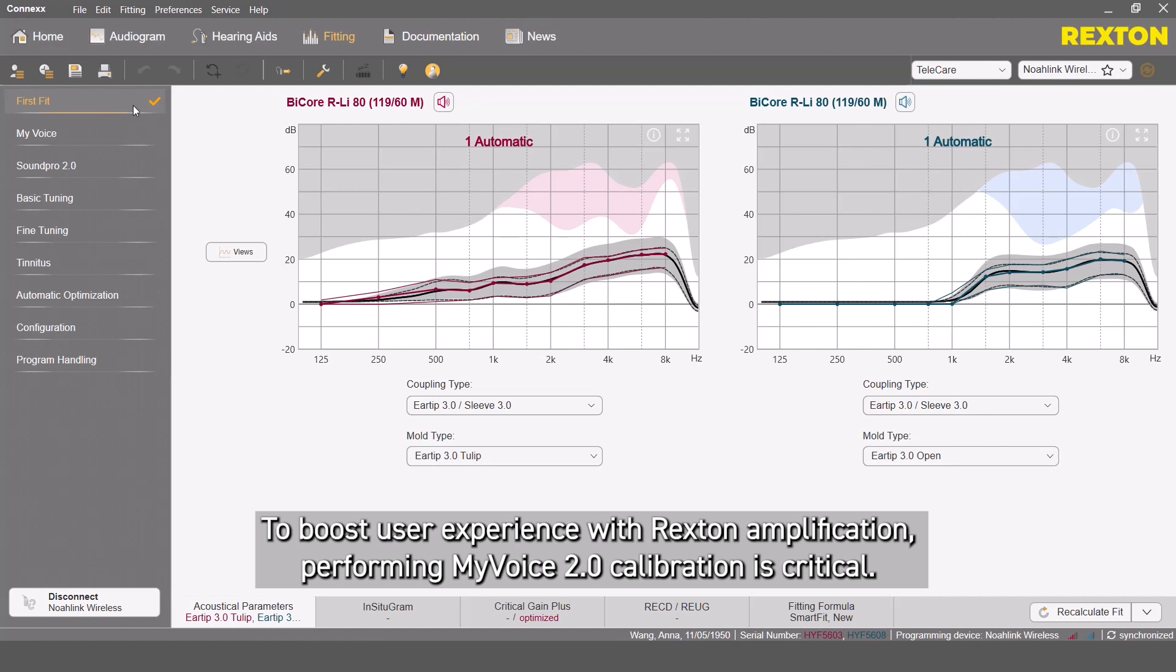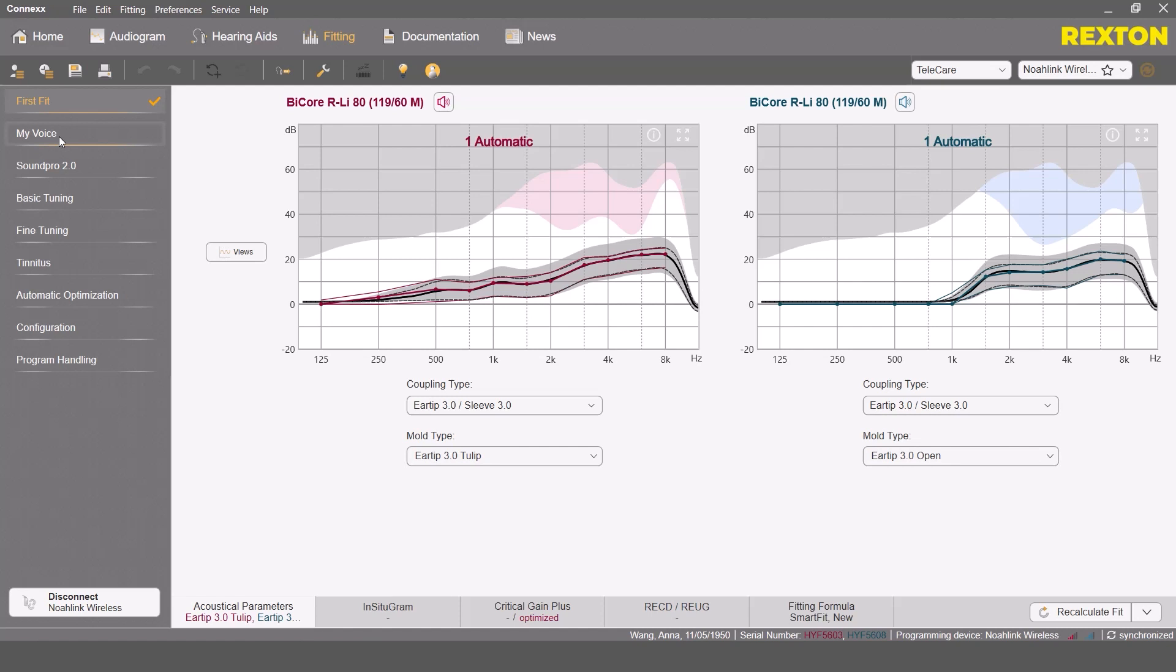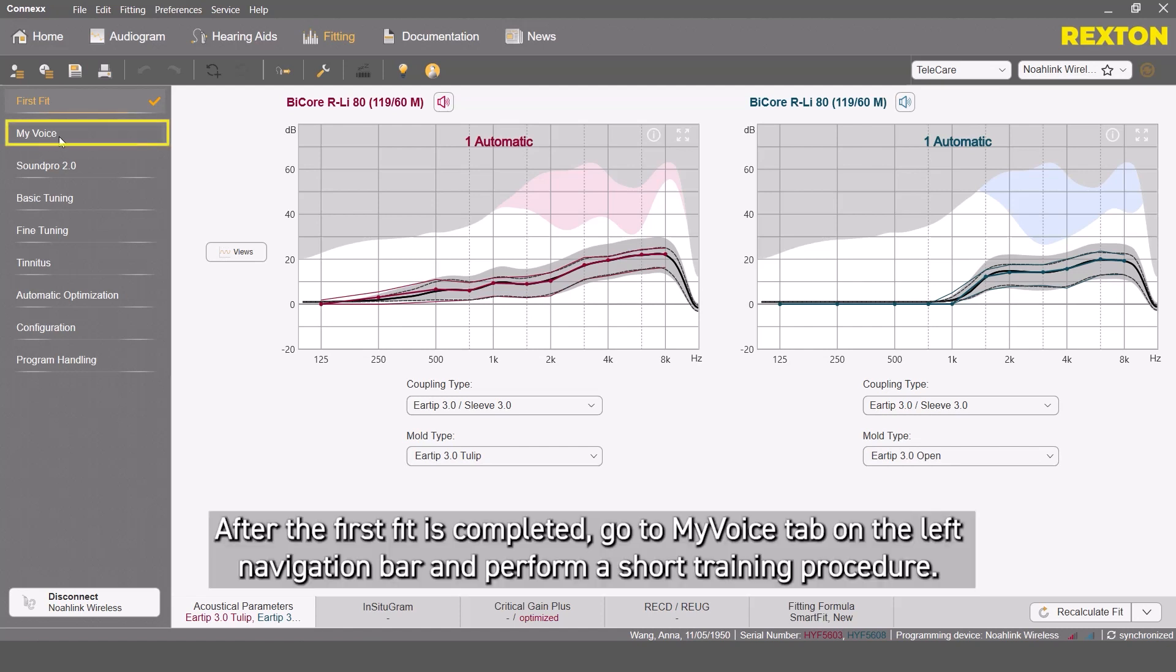To boost user experience with Rexton Amplification, performing MyVoice 2.0 calibration is critical. After the first fit is completed, go to MyVoice tab on the left navigation bar and perform a short training procedure.